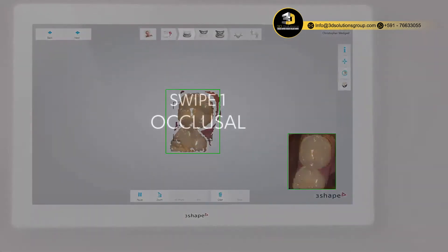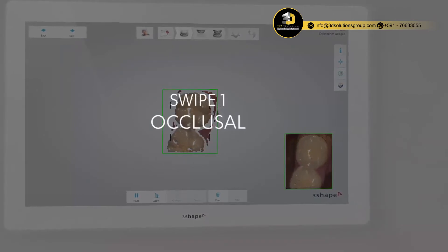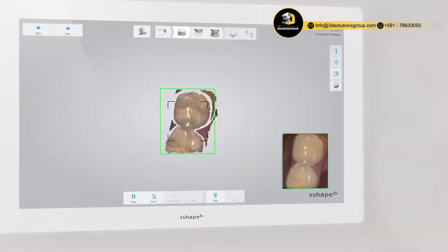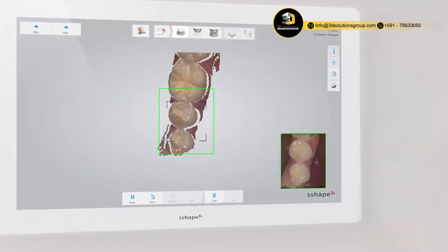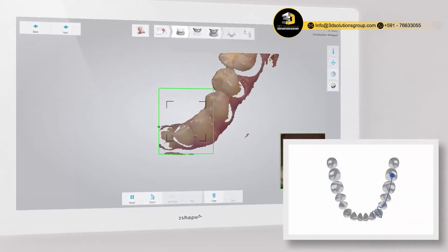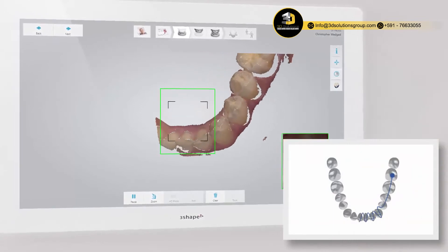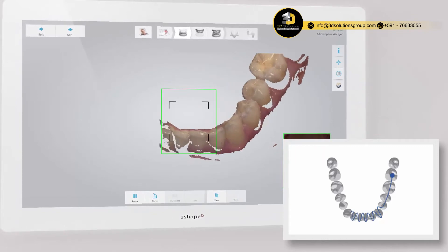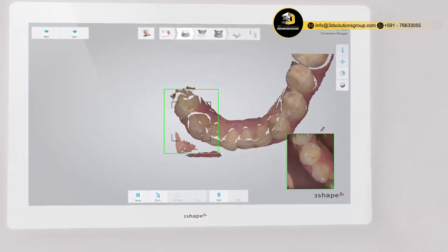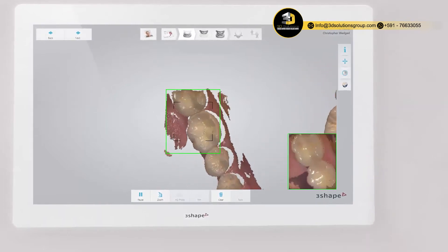The best scanning method is to start with the molar occlusal surface, since it has greater details for easier identification. Wait three to five clicks, then move towards the incisors. Slowly wiggle the scanner when passing the centrals and continue until you reach the last molar. Remember to move your scanner smoothly without jumping around.